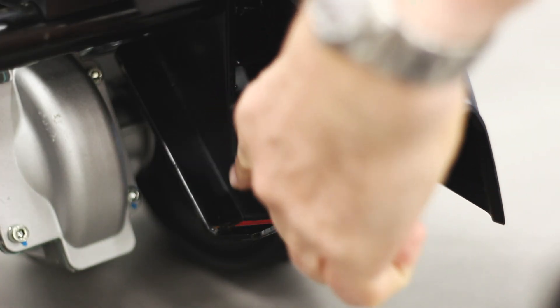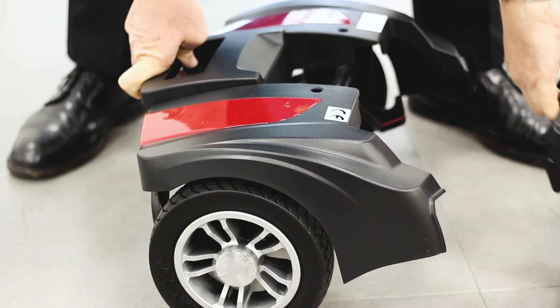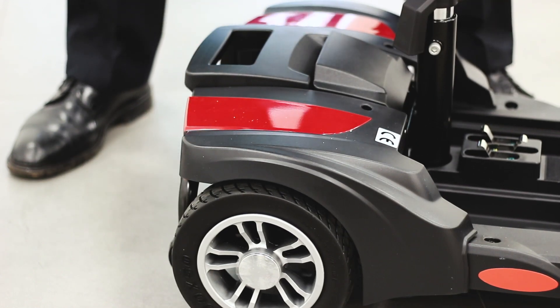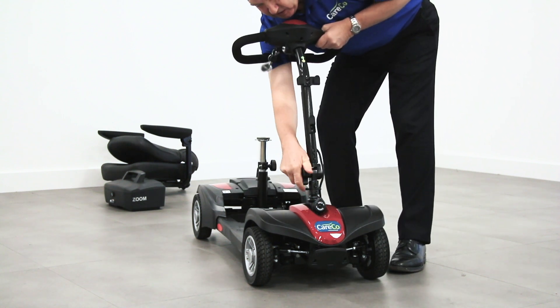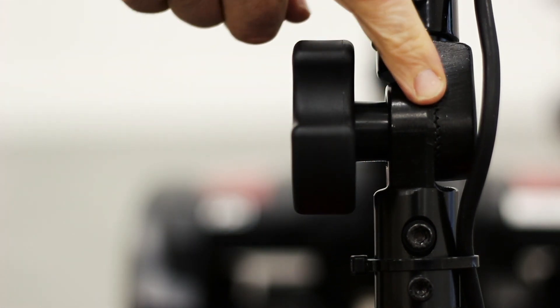To reassemble the scooter, ensure the hook for the front section is connected to the axle of the rear section. There may be red lines to help guide you. Lift the tiller bar to its upright position and lock into place by tightening the knob. Just make sure the teeth of the tiller bar are matched up.